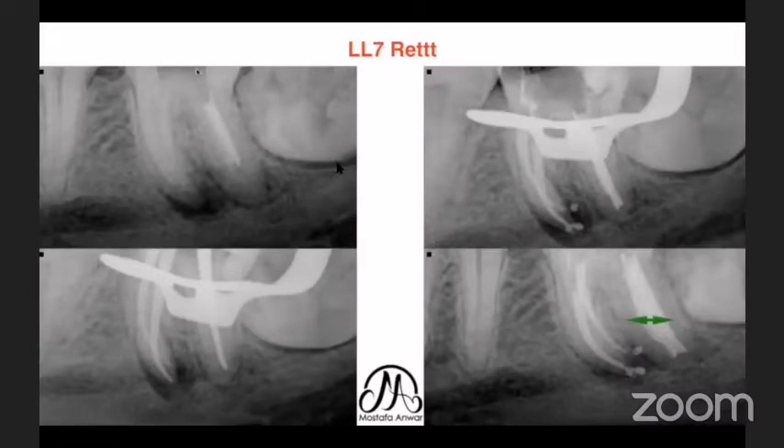In this case, I had a white material inside the distal root of a lower left second molar — unknown material that was difficult to remove. I used my ultrasonic tip with a cutting end to dig into the white material until it was removed. Then came the master cone X-ray and the post-operative obturation X-ray.